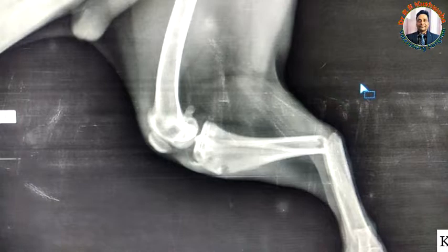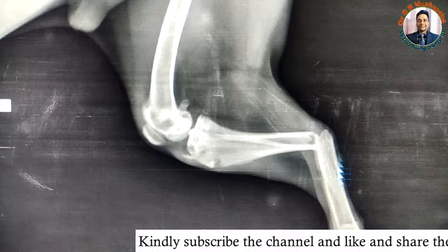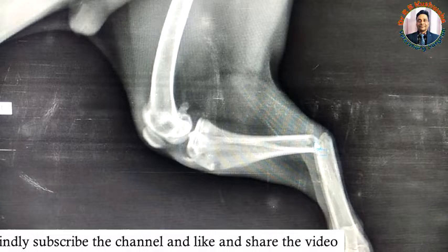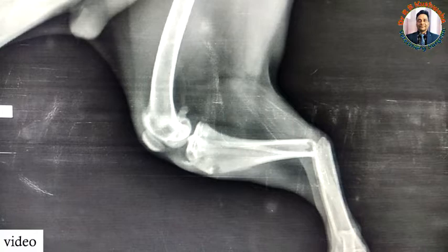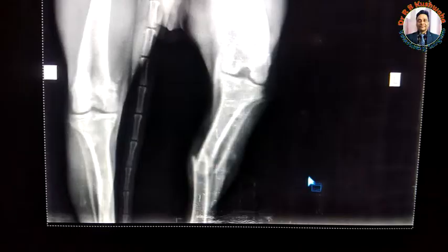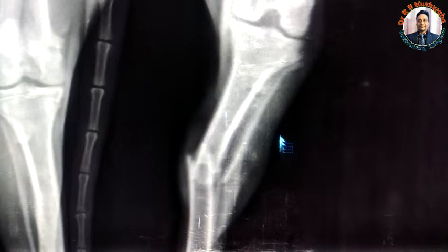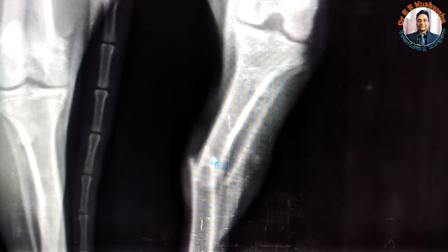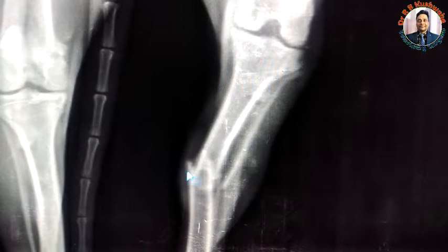This is the pre-operative radiograph of the affected limb — the mediolateral view of the tibia. You can see this is the proximal fracture fragment and this is the distal fracture fragment; there is a mid-diaphyseal transverse fracture. The proximal and distal fracture fragments are both deviated accordingly. In the orthogonal view — at right angles to the previous one — this is the transverse fracture with slight indentation of the fracture site. In this view the fracture fragment is deviated medially. Overall the fracture fragment is deviated caudally and medially.